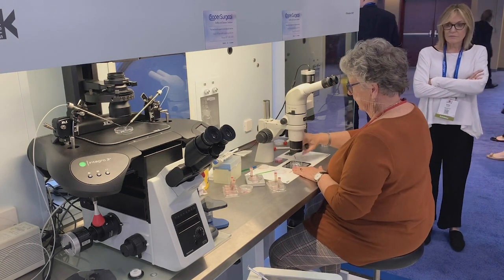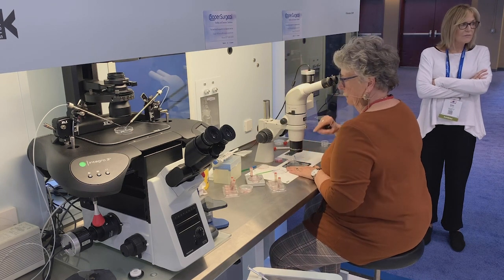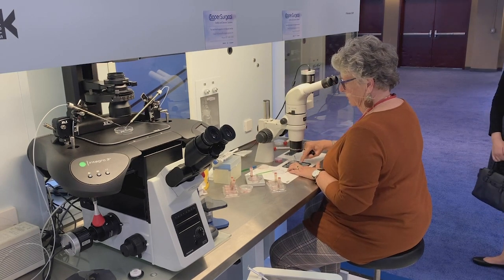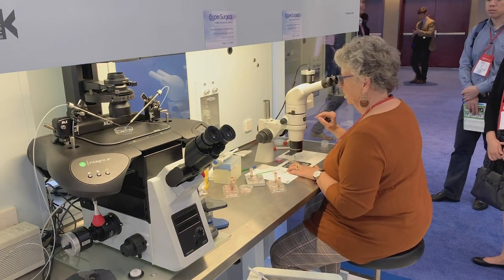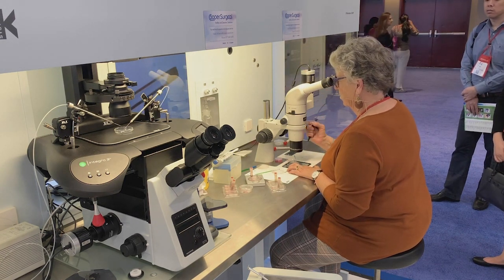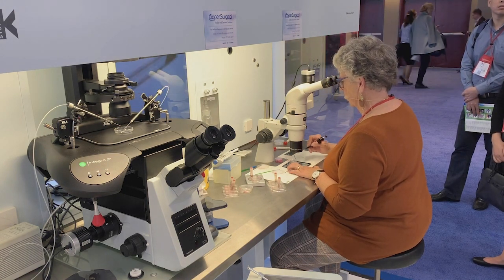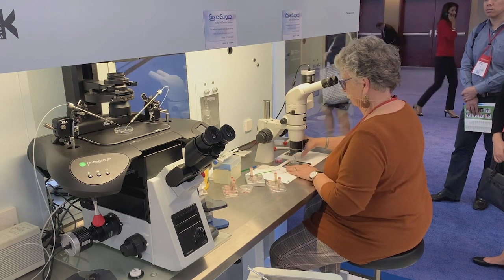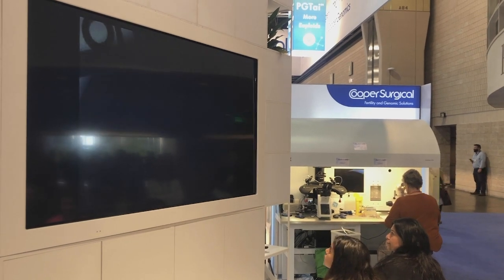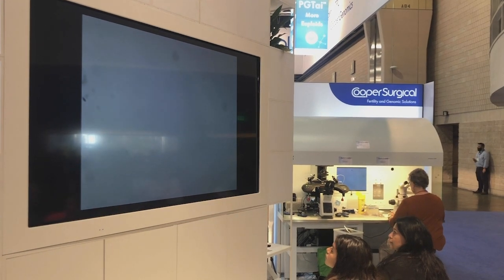So when you look at these devices, the nice thing about the VitriGuard is you can lay it flat on your surface. So I usually use a great big dish. We don't have those here today, but I just set it right down. The tip is not going to touch the surface of your heating plate. I'm going to want to put it on the device right above the black part here. You don't want to put it on the black part. And if you look for the Origio name on the device, that's in the same plane as the curve of the VitriGuard. So that's what I'm going to shoot for.